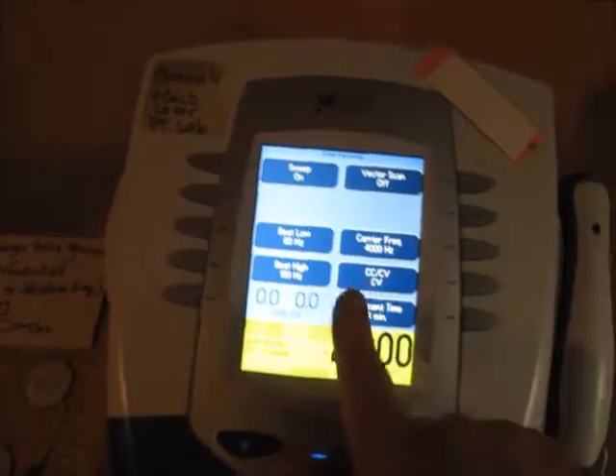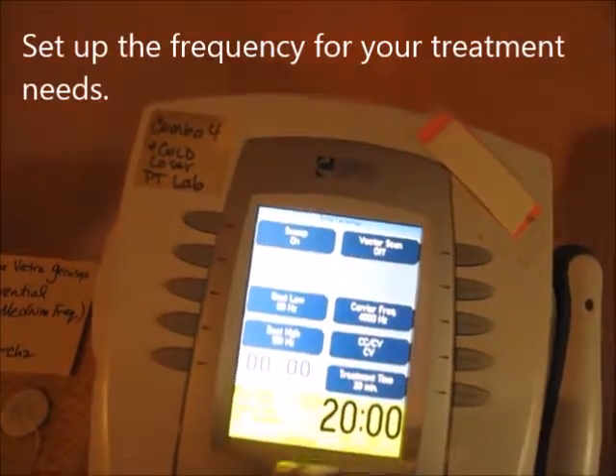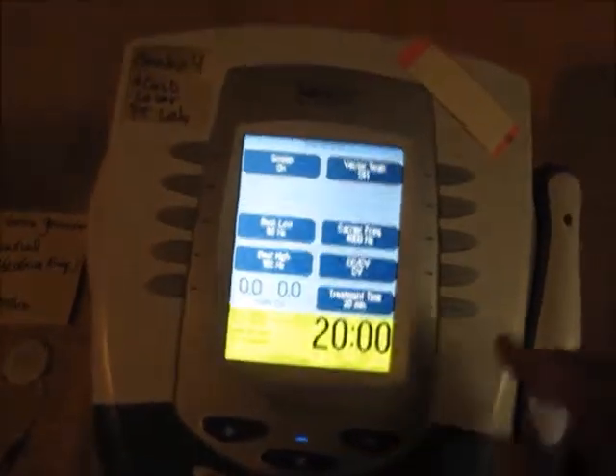Next you'll set everything the way you always do. Low amount of beats and high amount of beats — so 80 to 120 would be good for fatiguing. You can go all the way down to 1, so you could set it for myofascial adhesions at 1 to 10.